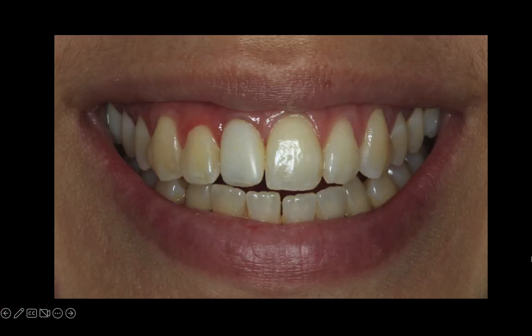You can also see cases like this, for example. This was a case that I had where she was referred to me to do a crown on this one to match this crown to this one. And of course, I did not do it that way. I had to send the patient to ortho to make room for me to do a nicer crown.